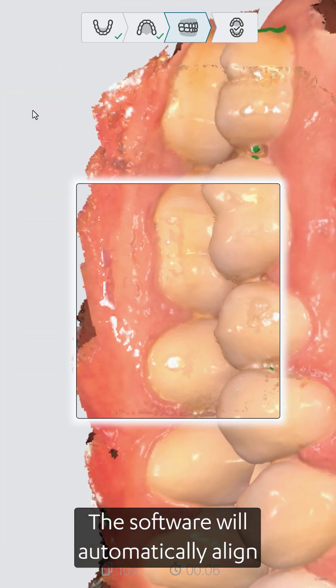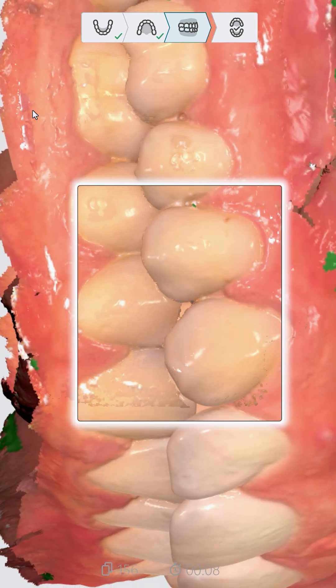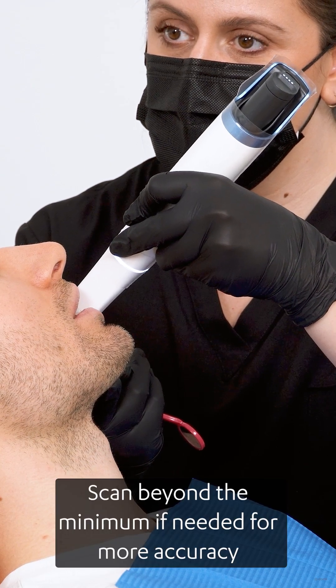The software will automatically align the upper and lower arches once enough data is captured. Scan beyond the minimum if needed for more accuracy.